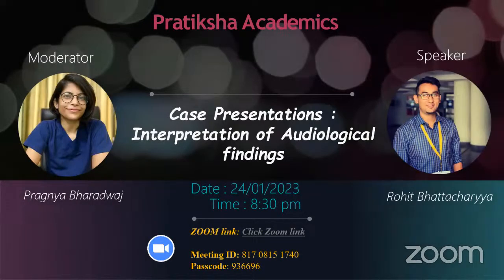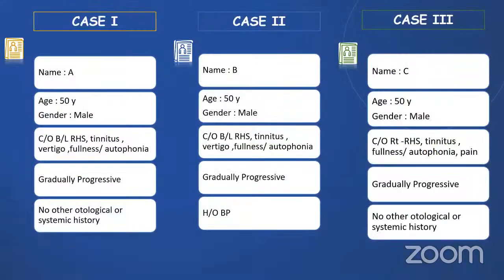The topic of my presentation is case studies on interpretation of different audiological findings for diagnosis of simple everyday cases that we experience. First, I would like to start by discussing three semi-hypothetical cases that we have experienced in our clinic, as well as some taken from the literature, for the interest of our discussion. All three cases have almost similar history: age of 50 years, gender male.